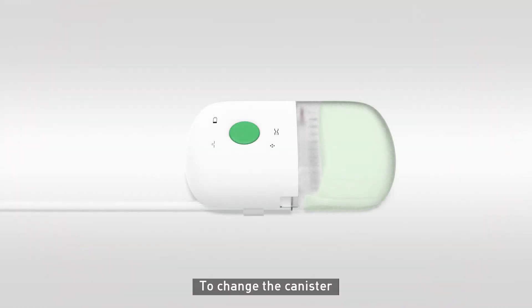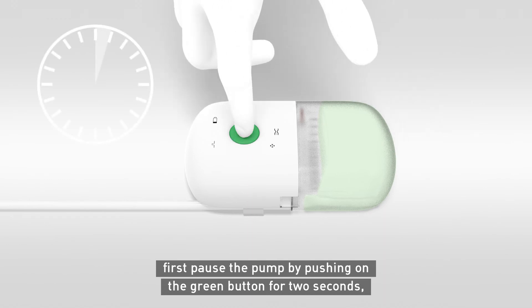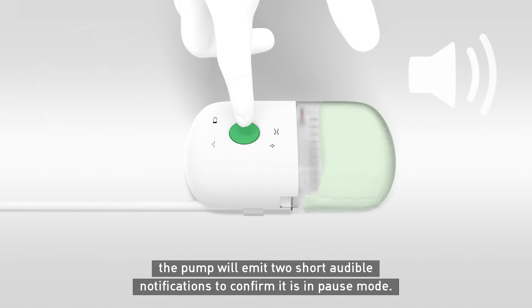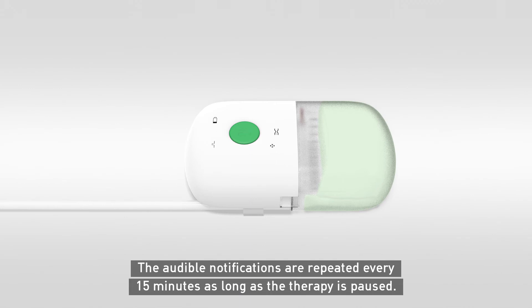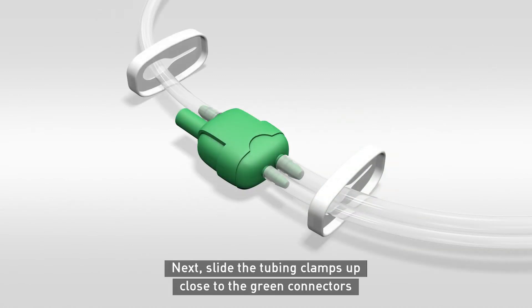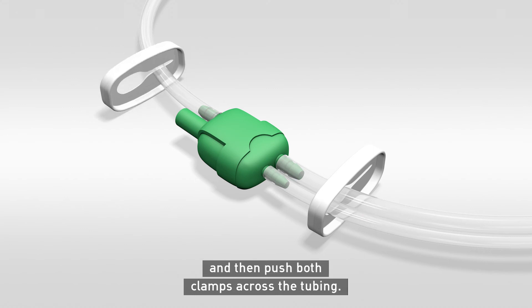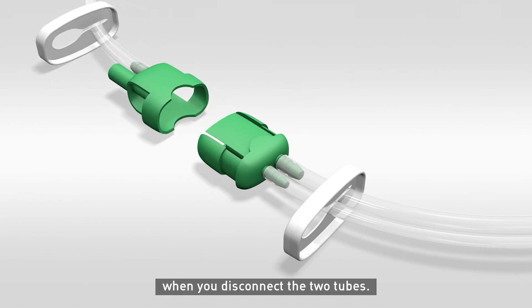To change the canister, first pause the pump by pushing on the green button for two seconds. The pump will emit two short audible notifications to confirm it is in pause mode. The audible notifications are repeated every 15 minutes as long as the therapy is paused. Next, slide the tubing clamps up close to the green connectors and then push both clamps across the tubing. This will minimise the potential for fluid leakage from the tubing when you disconnect the two tubes.